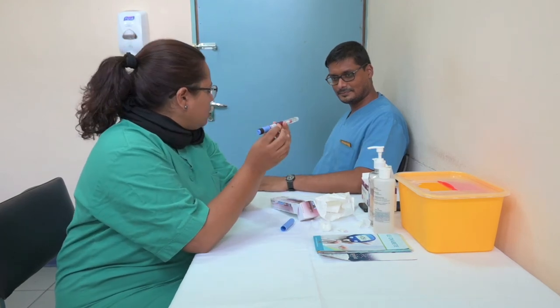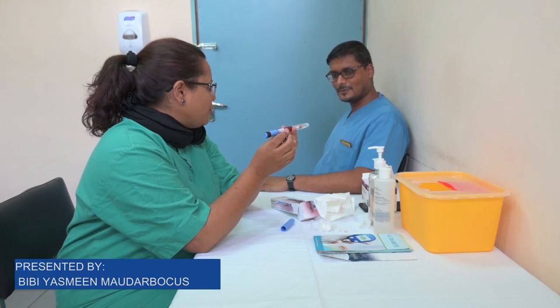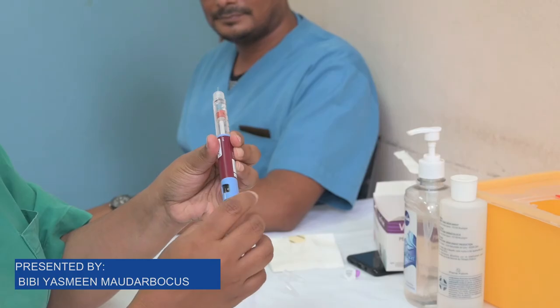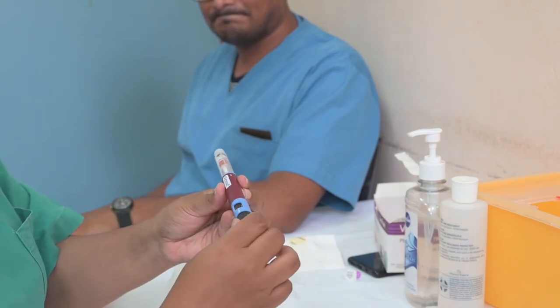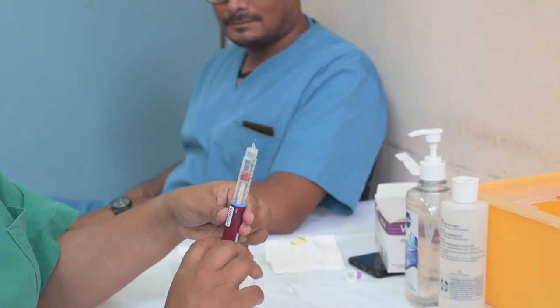You have to prime the pen. How to prime it? You have done it before? No. You just click one, click two. You have to dial number two, then you point it up toward the ceiling, then prime it. Press the knob. You see insulin coming out. Okay. Now the insulin pen is ready.